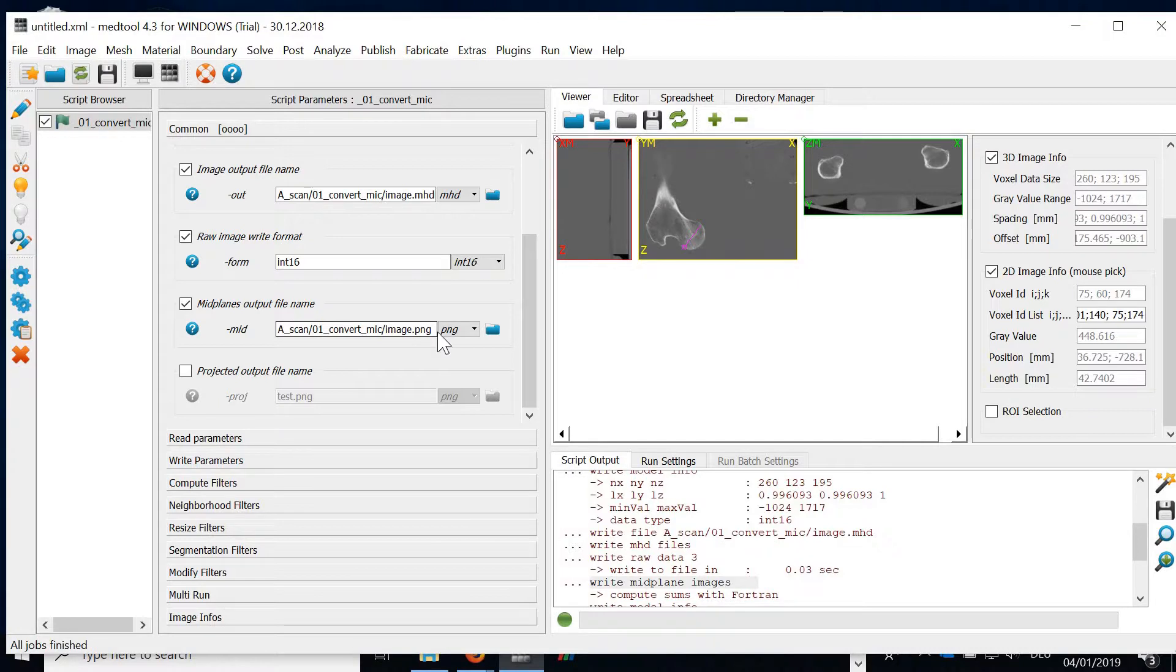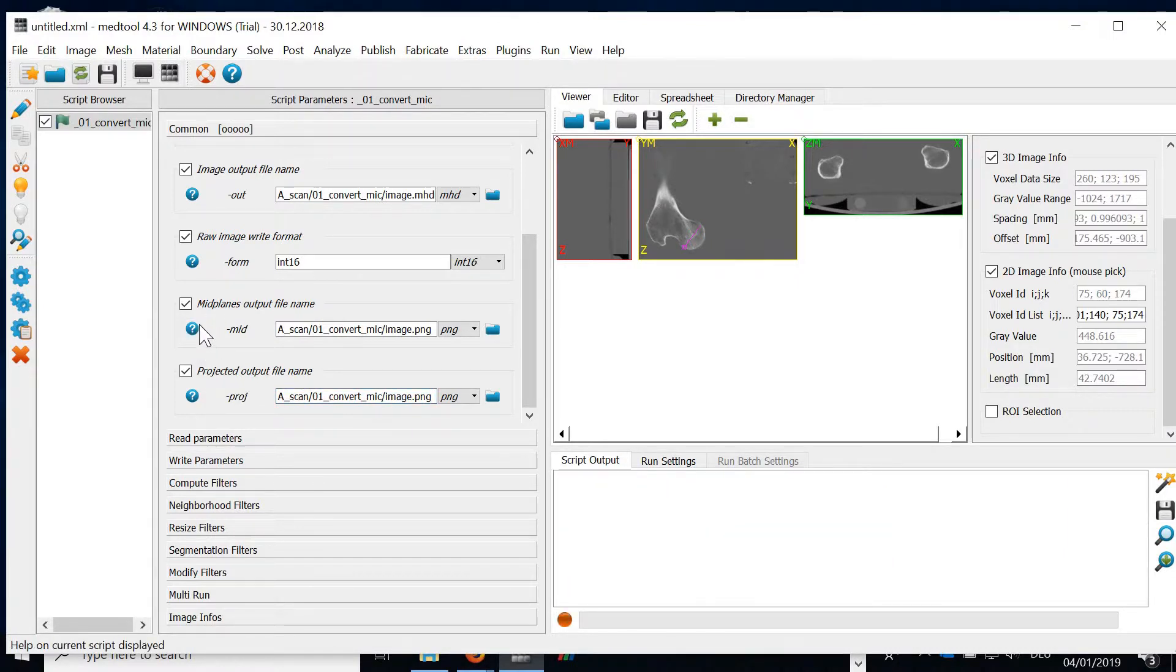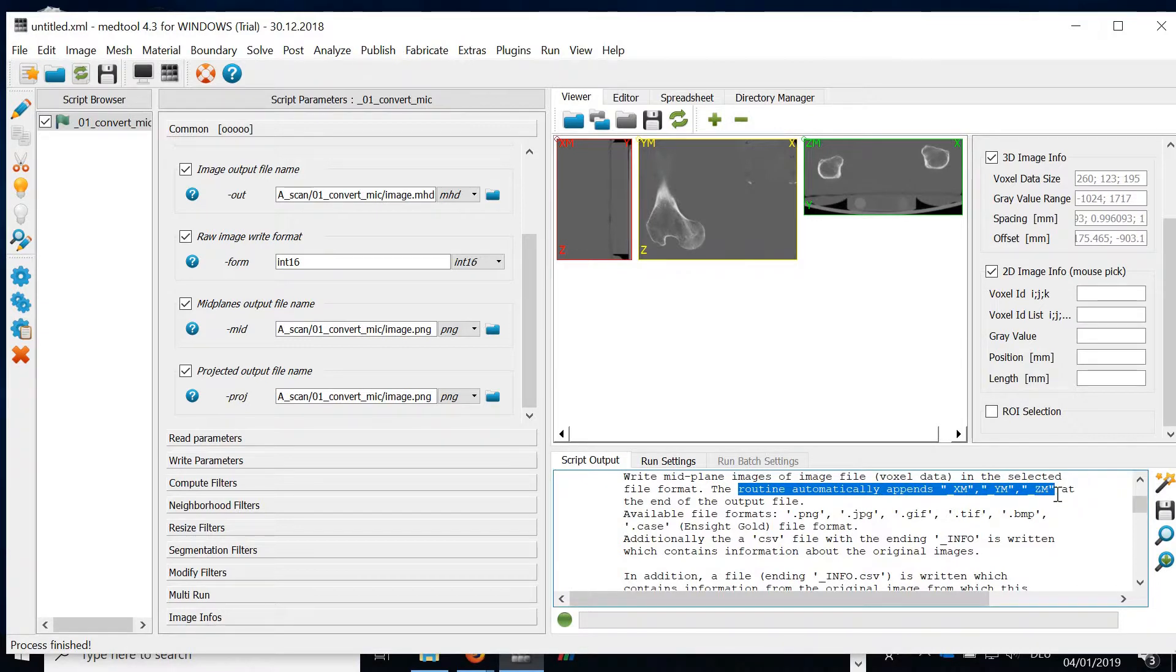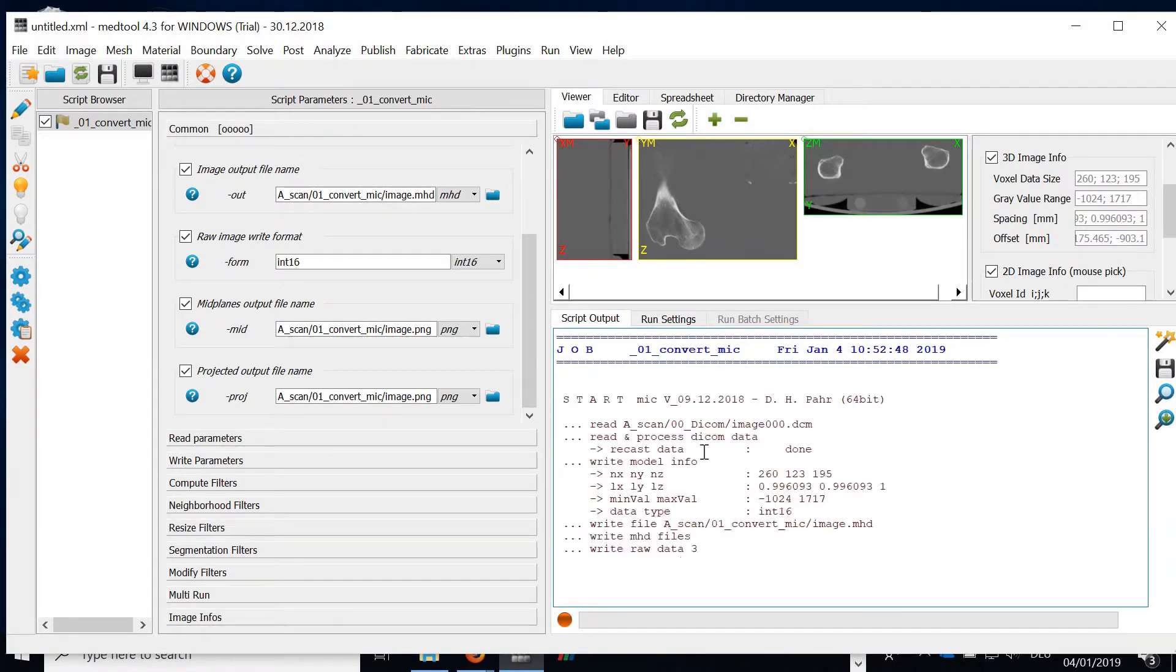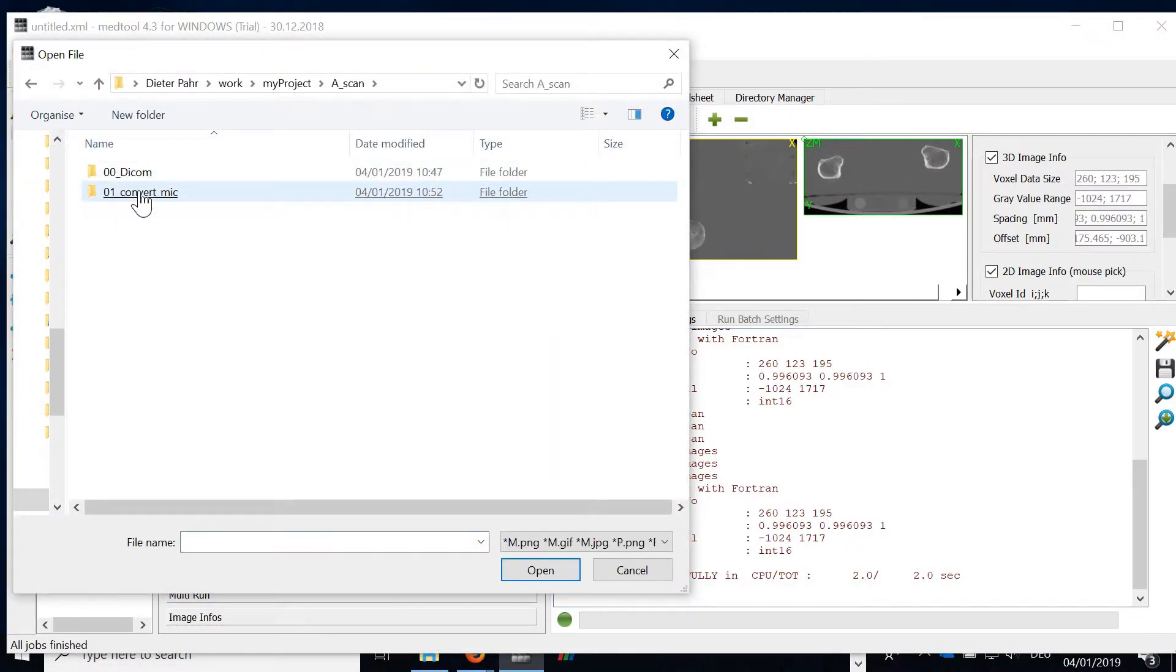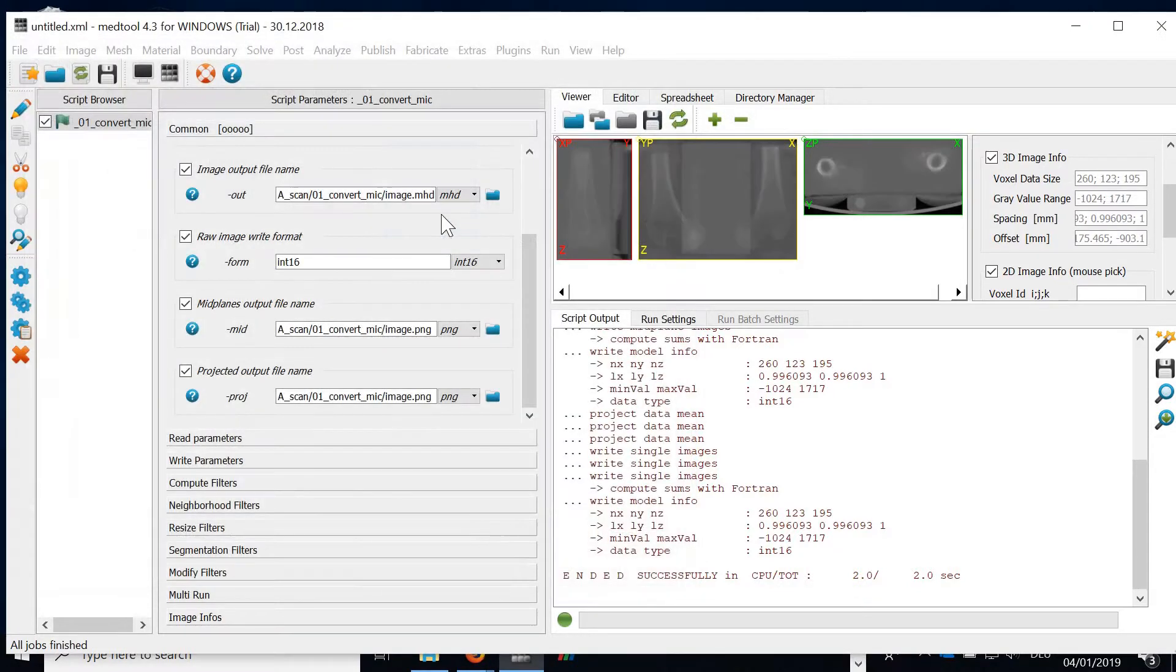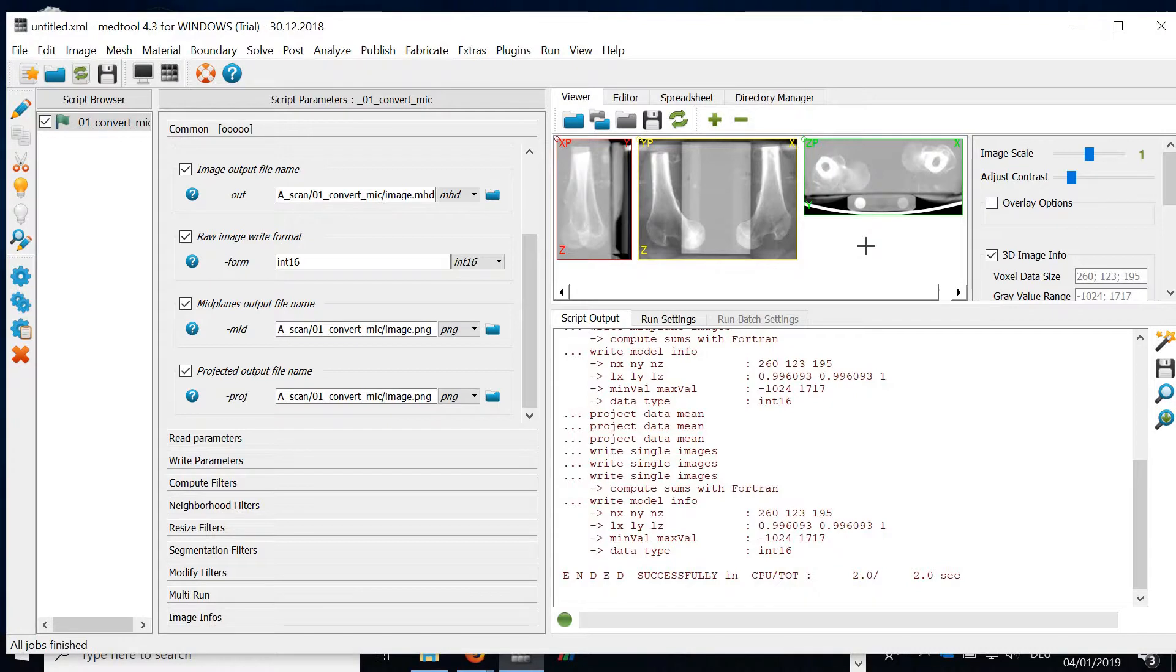So the second possibility is we also write out a projected image. Because Medtool automatically appends the ending. We see that the projected image is also written. We see images which has the end in P for projected. If we open the images, we get a different view. It looks like X-rays. We see here nicely that there are two femurs and the phantom is inside this dataset.